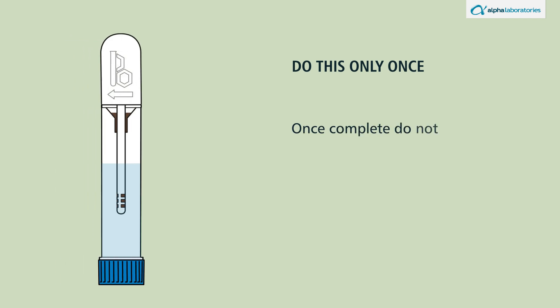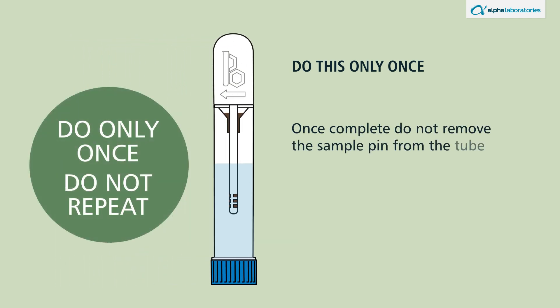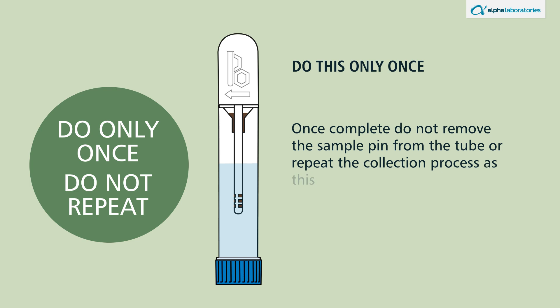Once complete, do not remove the sample pin from the tube or repeat the collection process, as this will lead to inaccurate or incorrect results.